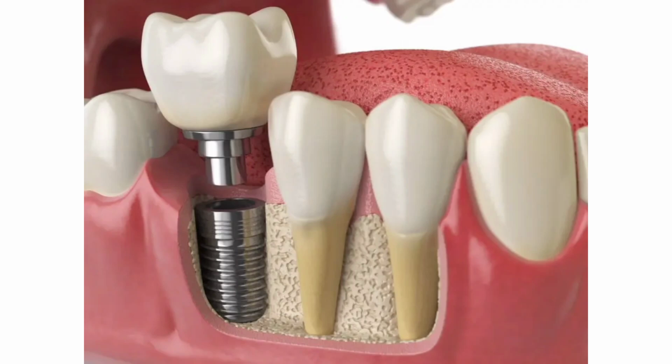But usually this step is completed well before the implant placement procedure to allow for the bone graft to fuse with the existing bone. At times, soft tissue graft or bone grafting may be needed during the implant procedure as well, due to some inadvertent bone or soft tissue perforations during surgery, especially in the jaws with weakened bone quality.